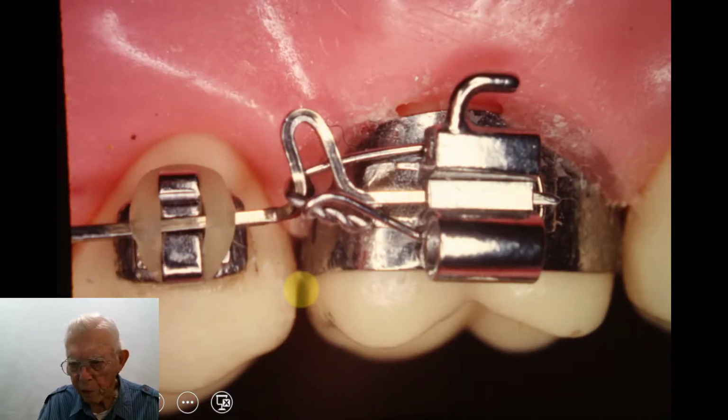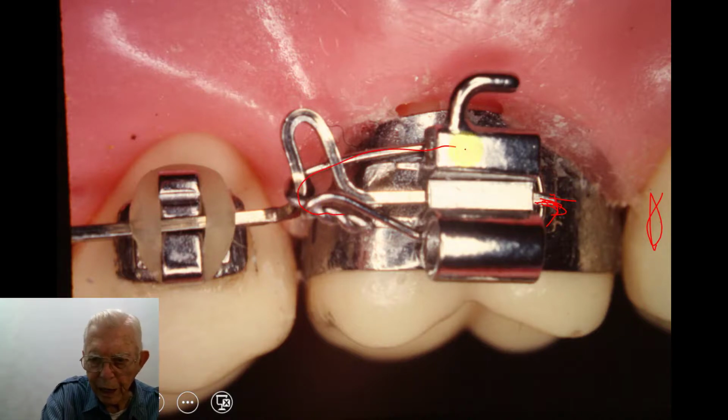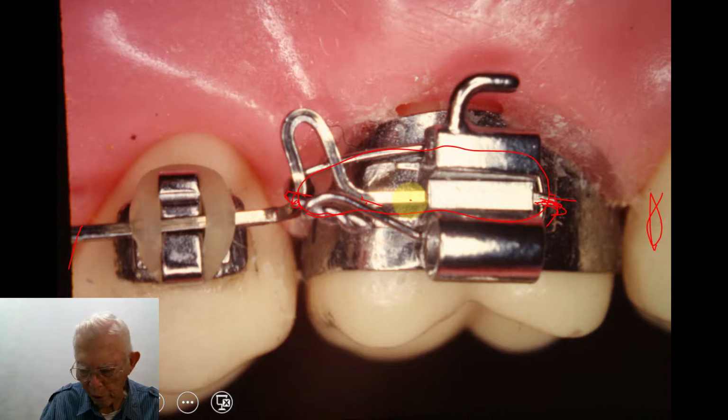And this is where, if you're up above, we don't put anything back on the second molar up here. You just come out, you cut this thing off, and you have to sometimes smooth it down a little bit so it doesn't hook the person. And now this is a tie that we go around and tie this back. And you can push here with your director and push this and tighten as much as you want to, but you tighten one side where you want it, and then you go over and tighten the other side. But this one you wouldn't push it all the way in there. You tighten from one side only. Really, I made a little error there.